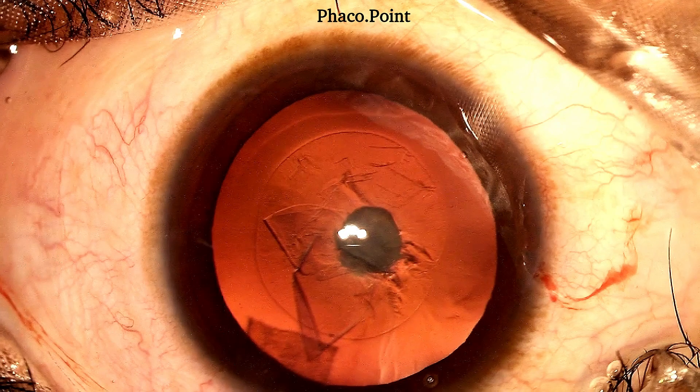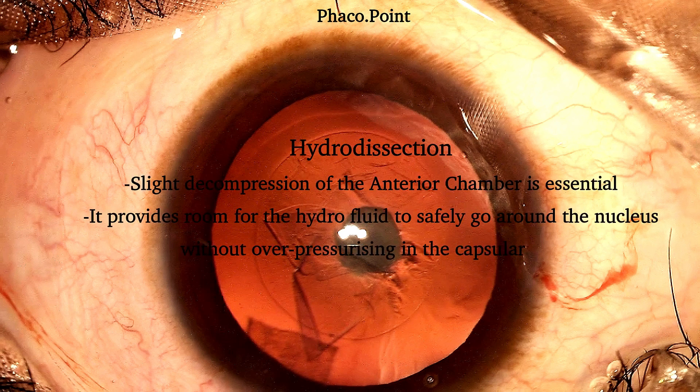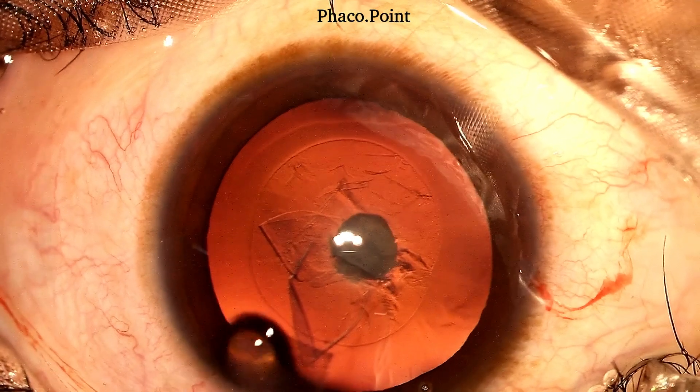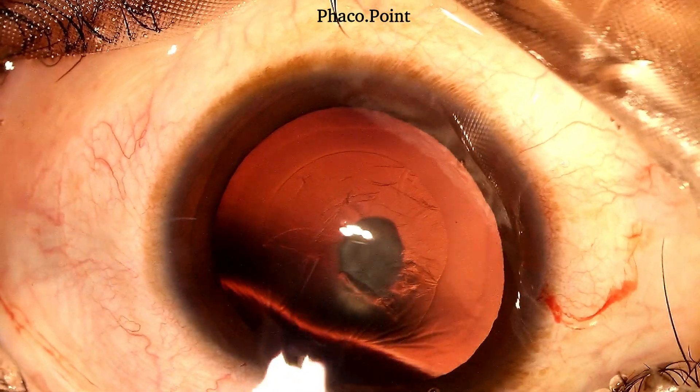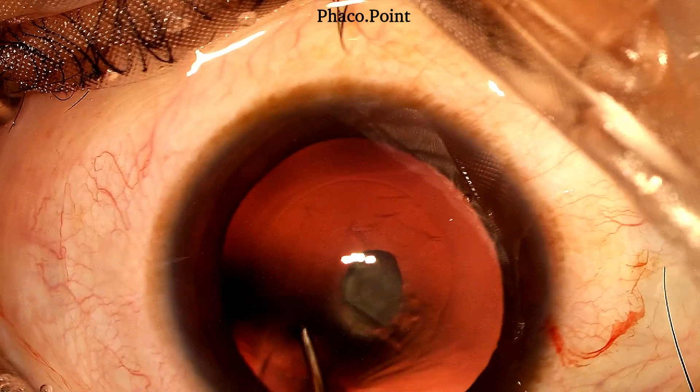We now come to the hydro procedure. Traditionally when we perform hydrodissection, I always suggest we do need to reduce the anterior chamber volume a little by pressing on the posterior lip of the main incision. That gives a little space for the hydrofluid to make its way around the nucleus without over-pressurizing the capsular back, thereby reducing the risk of a PC blowout. Even in patients with posterior polar cataract, I perform a very slight decompression to make a little more room in the anterior chamber.